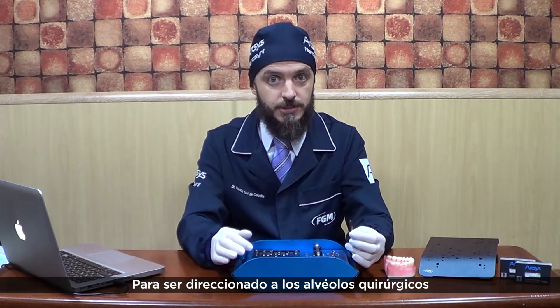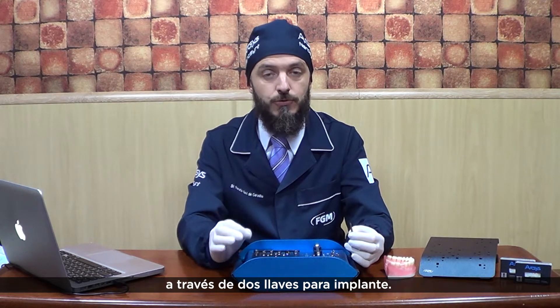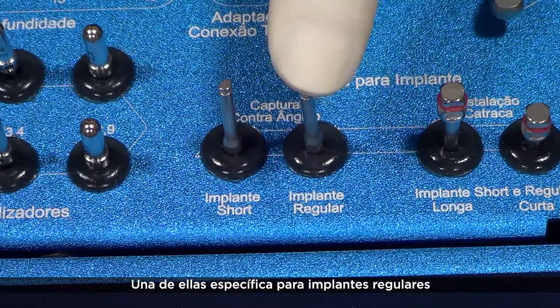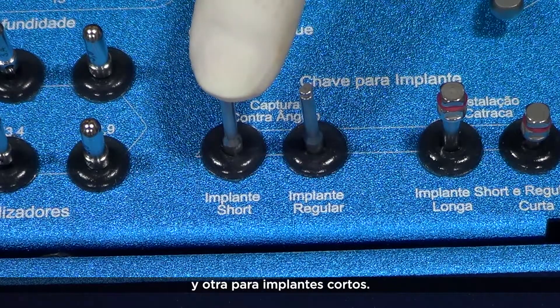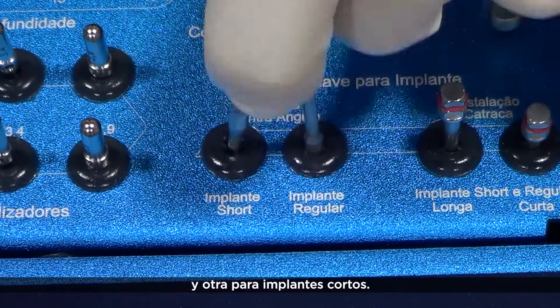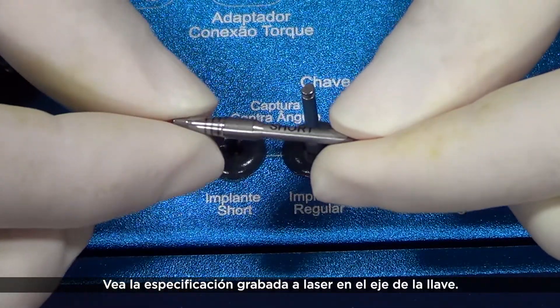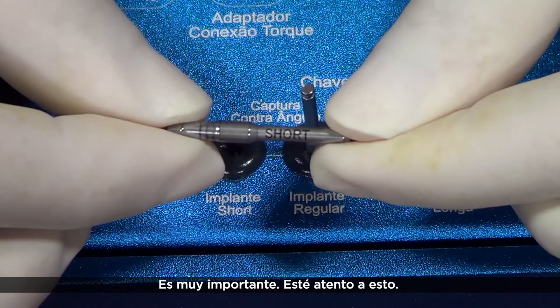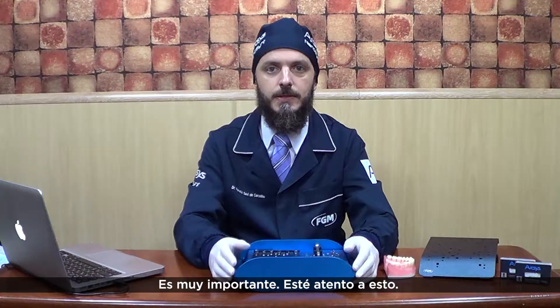To be driven to the surgical sockets, Arxis implants must be captured through two implant drivers — one specifically for regular implants, and another only for short implants. Find the laser-engraved specification at its rod. That's very important. Pay attention to that.